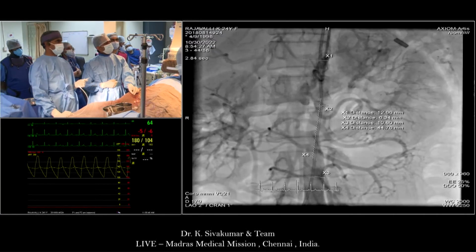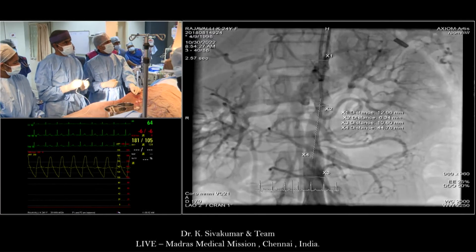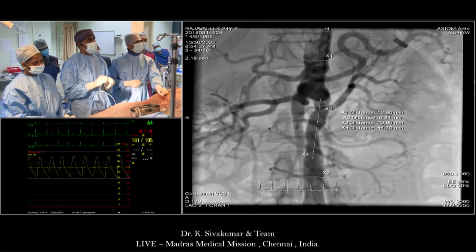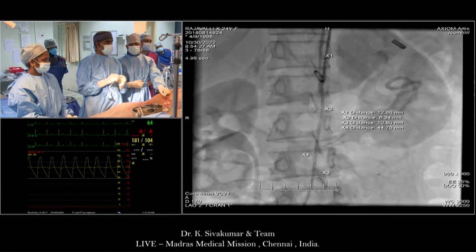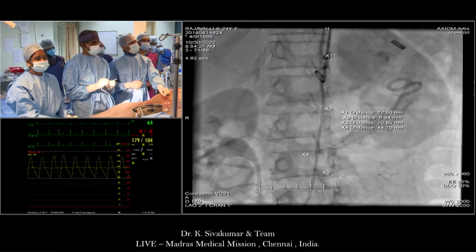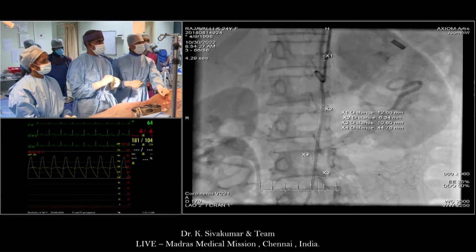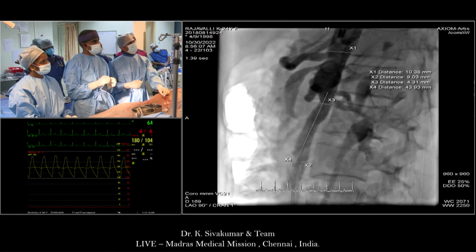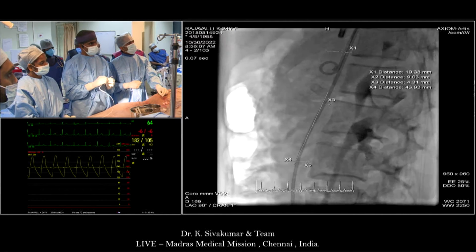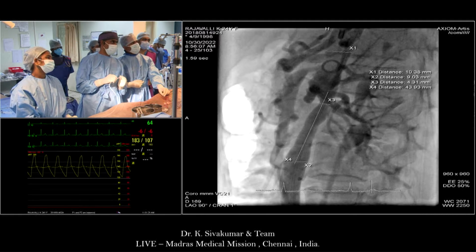As was mentioned earlier, this right renal artery was recanalized and we stented it maybe less than 1 year ago, when she had very refractory hypertension and a total occlusion of the right renal artery. So at that time, the aorta is around 12.6 proximally, 11 distally, and the narrowest portion is 6.3 with a length of around 45. Next, lateral view. In the lateral view, freeze it. Okay. So again, the narrowest part is about 4.3.